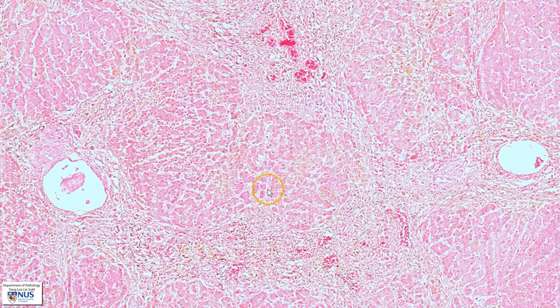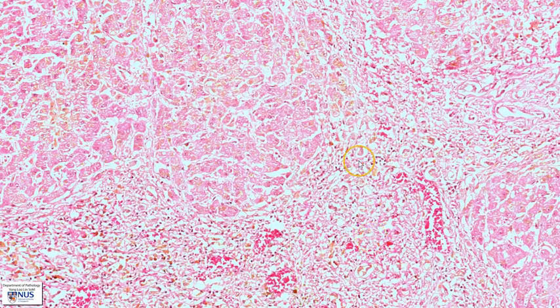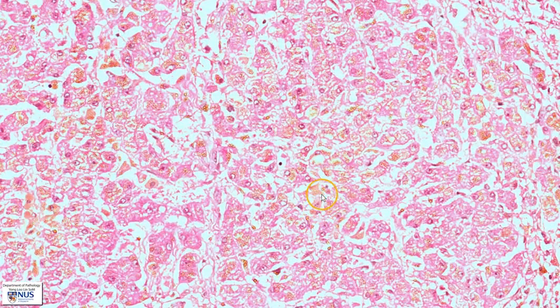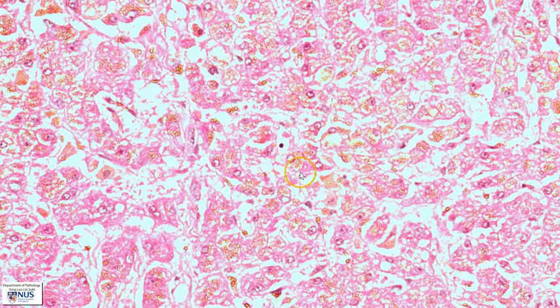Moving on to higher magnification, we can see that the hepatocytes are still arranged in cords or trabeculae, and there is a brownish discoloration involving many of the hepatocytes. We can also see this brownish discoloration within the fibrous septa. Let's take a closer look at the hepatocytes. Within the individual hepatocytes, we can see this deposition of brownish iron pigment.